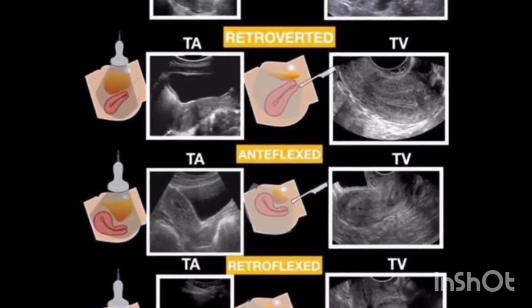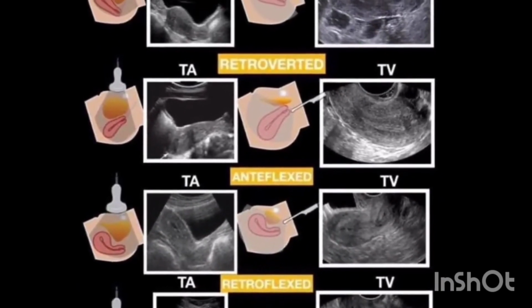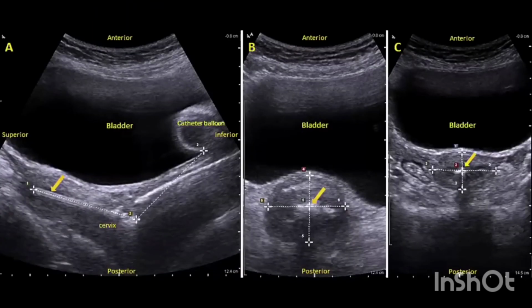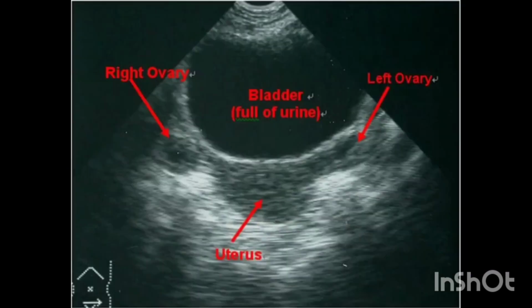The endometrium, myometrium, and cervix should be carefully evaluated and their appearance documented. The uterine length is measured in long axis from the fundus to the cervix, and the anteroposterior dimension is measured on the same image perpendicular to the length. The width is to be measured on a separate image on either a transaxial or coronal plane of section. If the volume of the uterine corpus is assessed, the cervical component should be excluded.